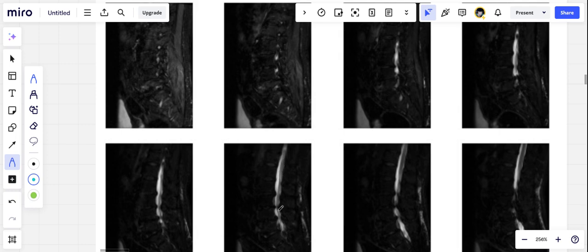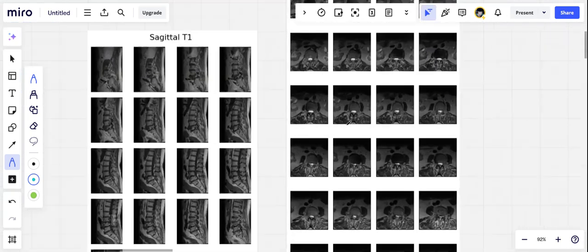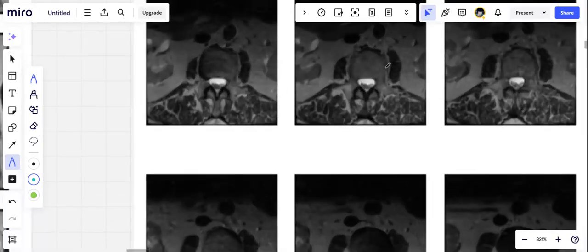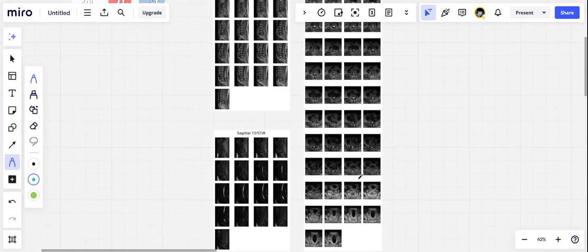I can see clearly here this white part. This part is white because the spine has a cushion-like membrane inside which there's a fluid called cerebrospinal fluid. Since it contains mostly water, this part appears in white color. The settings can be changed to modify which density of liquid, how much water concentration, should be displayed as brighter and which should display as darker. This one is the axial scan, which is seeing from the top. This is the white part. This is the spine.